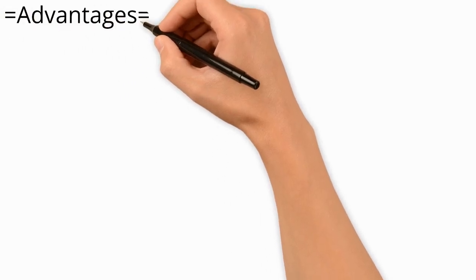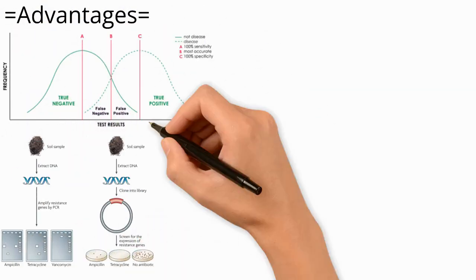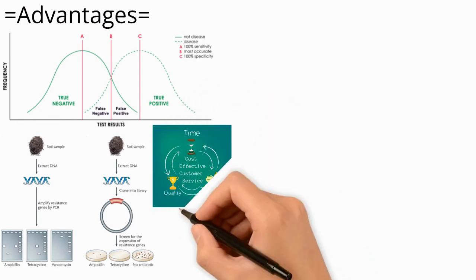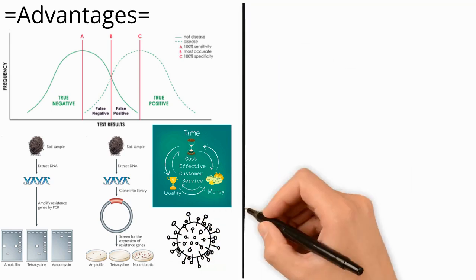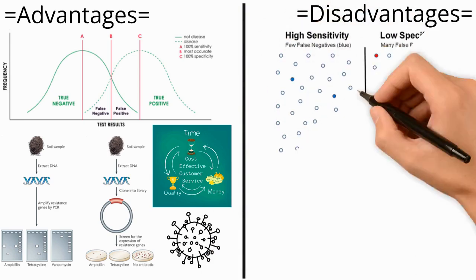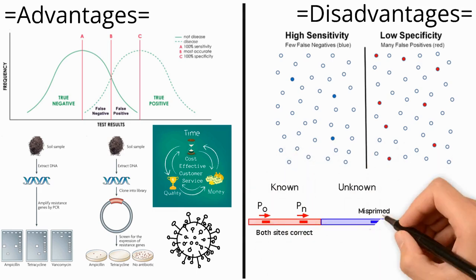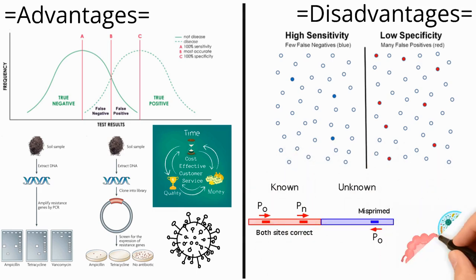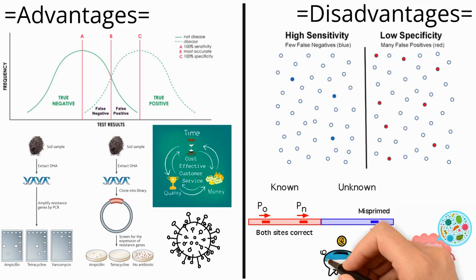The advantages are high sensitivity, ability to test antimicrobial resistance, shown to be more cost-effective with selective use than culture and staining, and increased ability to detect less common organisms such as viruses. The disadvantages are a potentially lower specificity compared to the culture and staining, a need for a narrow list of causative agents to use specific primers, the possibility of amplifying normal microbiota, becoming less cost-effective when performed with a multi-organism PCR approach, and supply cost, machinery fees, and training expenses.